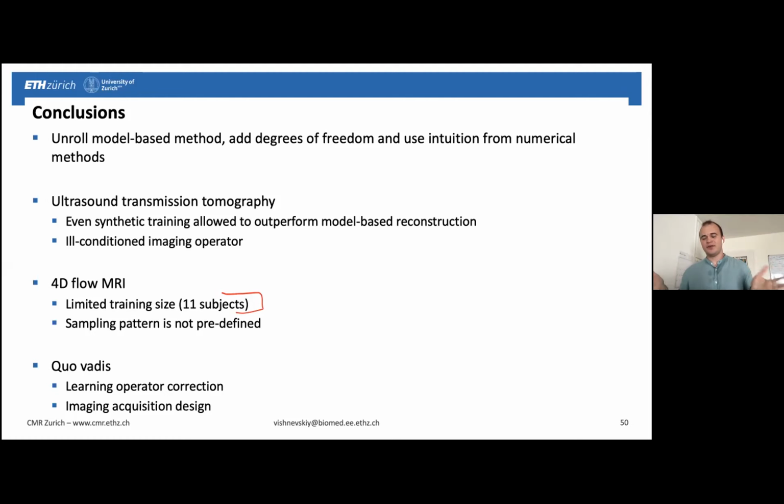So in most of the architectures where 20% improvements are reported, if you evaluate them on prospective data, so real undersampled reconstruction on the scanner, where we have slightly different magnetic gradients and therefore a little bit more artifacts that are not incorporated in the model, then a lot of machine learning models can start to degrade.